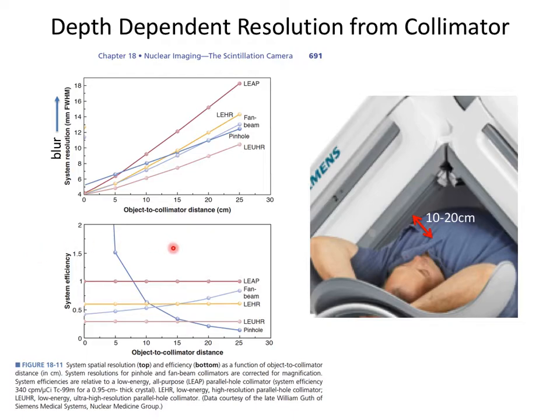As we discussed before, there's a trade-off between putting the anti-scatter grid septa closer together, which would give us a higher spatial resolution at depth, but then you lose photons, and so the efficiency of the system is reduced. Down here, I wouldn't worry about this so much, but this is an effect that is the reason why nuclear medicine is a blurry imaging modality.